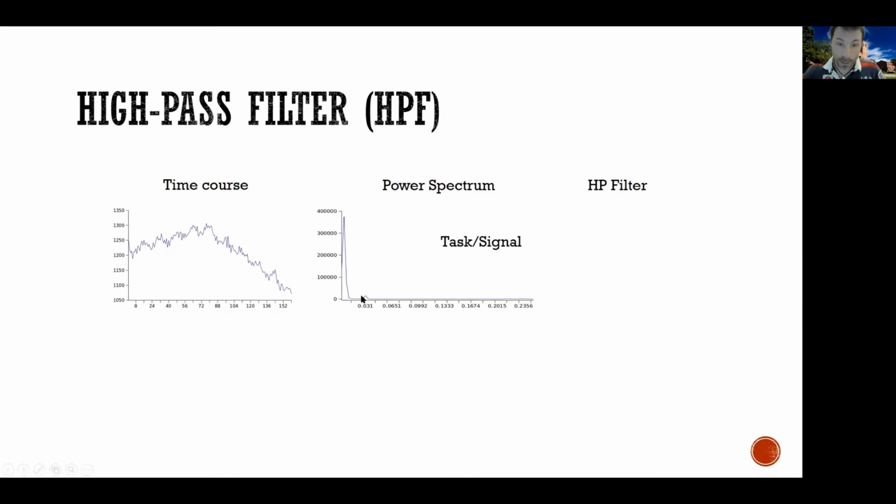So what is this? That's my signal. This little thing here is the power of the ups and downs that happen during my signal. What is this gigantic, ginormous thing right here? That's noise. Any other wiggling, see this wiggling up here? That's all noise. So look at this power spectrum and tell me, how good is the signal to noise ratio? It sucks. Too little signal, too much noise. We've got to do something about this.